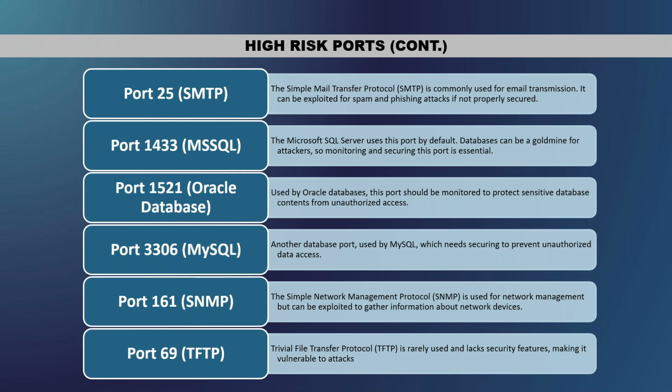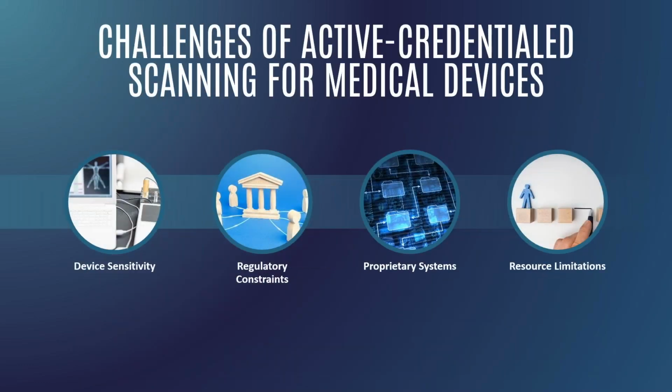Next slide. Okay, now we're going to talk about active credentialing. As MFA is being pushed, so is active credential scanning, right? Active credential scanning is not going to be listening in; it's just going to be probing the system to evaluate the vulnerabilities. It is the ideal solution. However, a lot of medical systems cannot support active credential scanning.